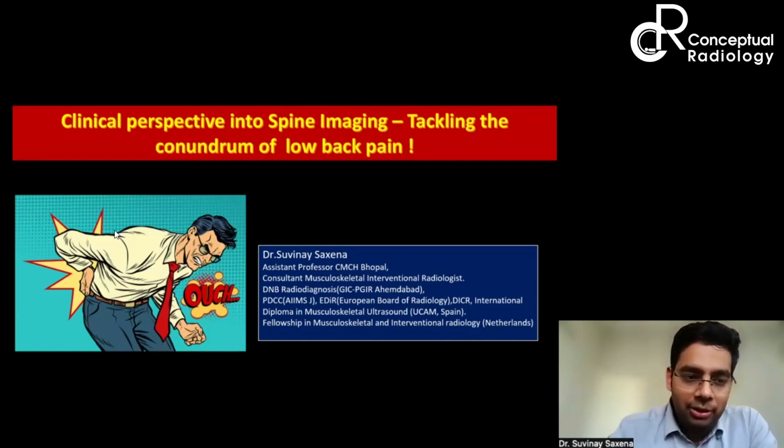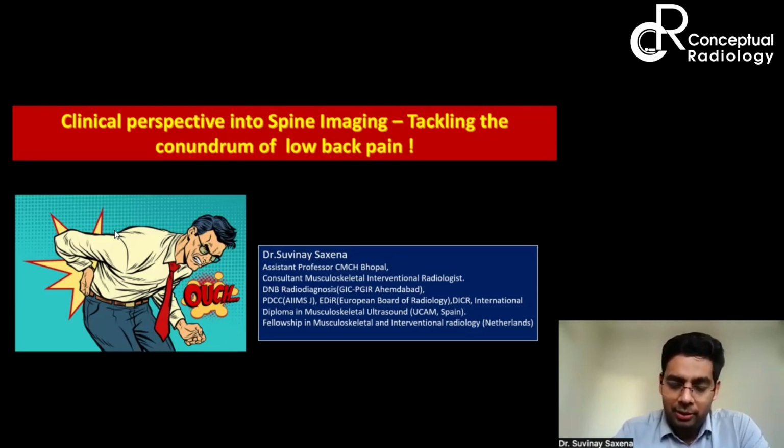So basically, what I'm going to talk about today is a clinical perspective into spine imaging, and we're going to talk about different low back pain scenarios. But before that, how do we approach a patient with a low back pain MRI? That is my goal for you guys.